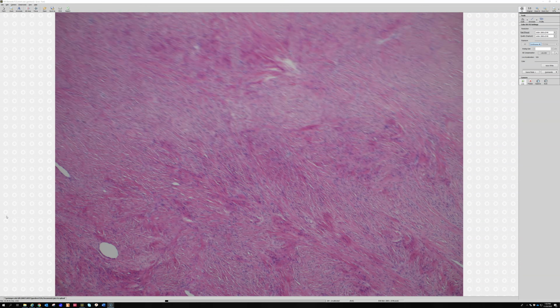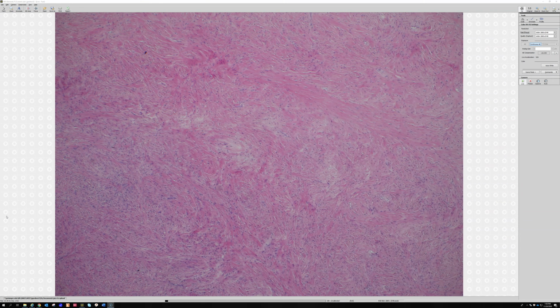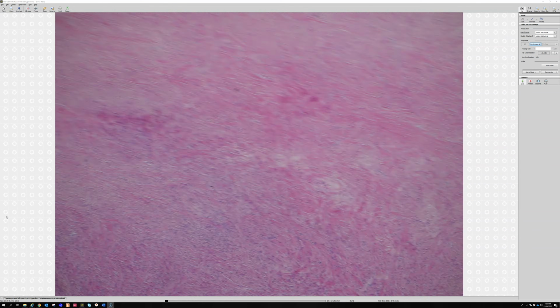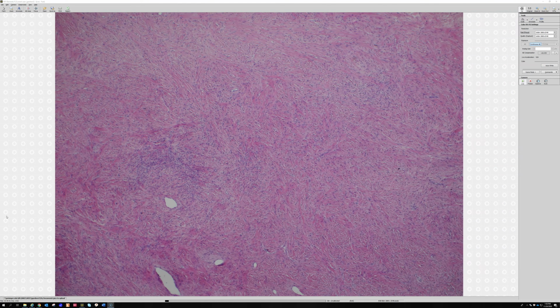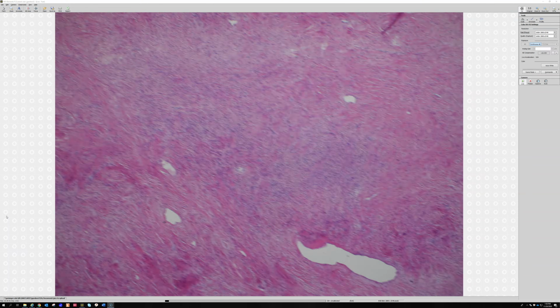They look like a neurofibroma, like a perineurioma. Maybe sometimes they can swirl and look a little like a DFSP or solitary fibrous tumor. They can look like a lot of those things, but they don't usually look malignant. So recognizing that variability in the collagen-rich and sometimes more myxoid areas is key.